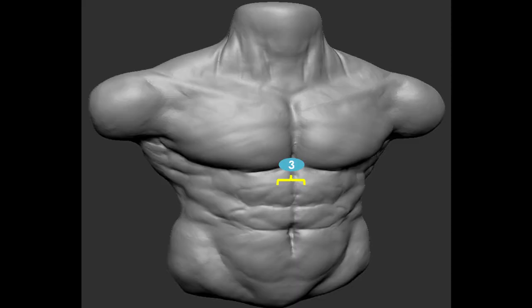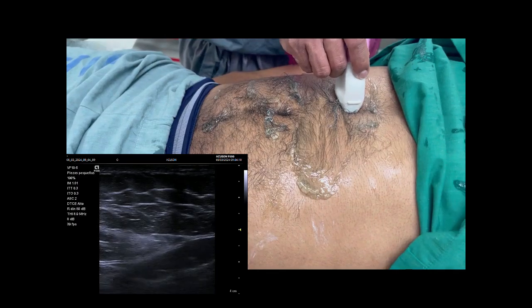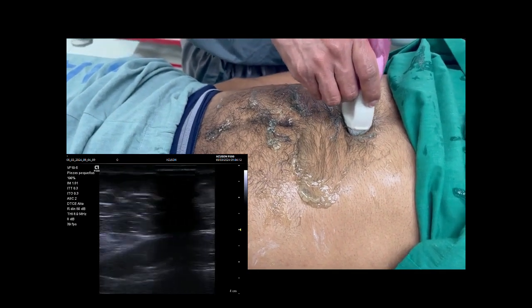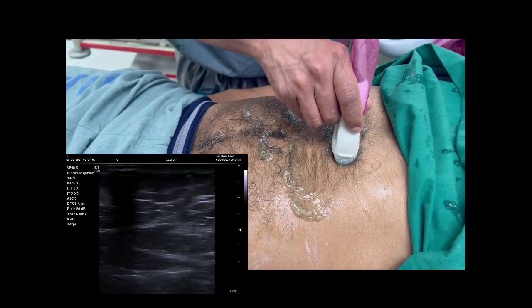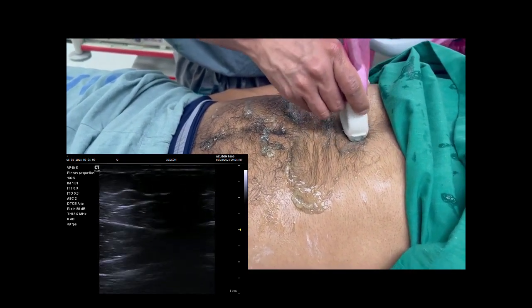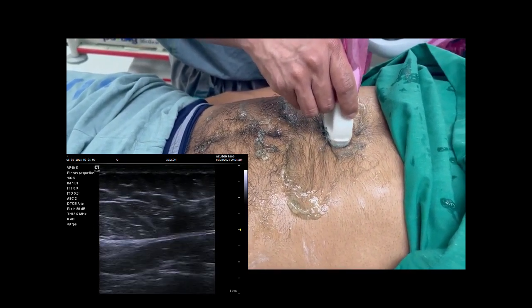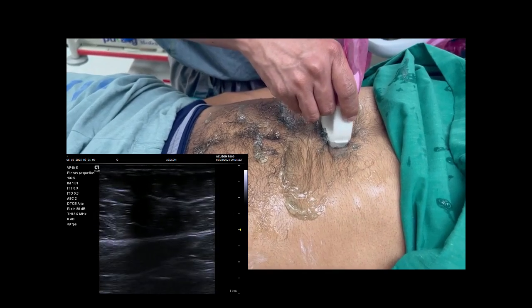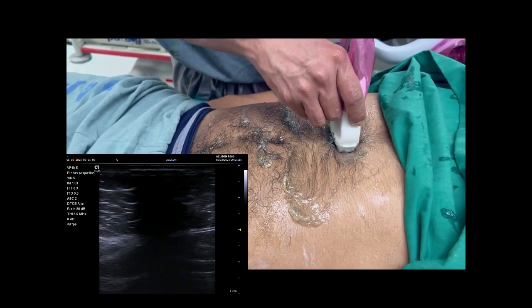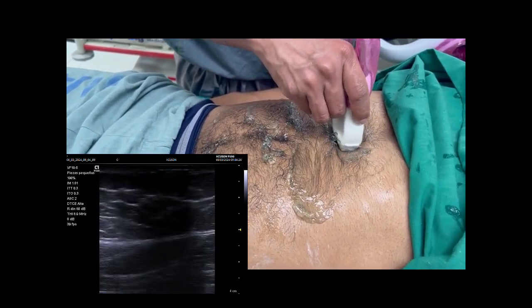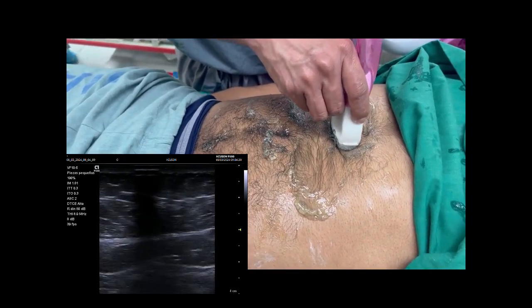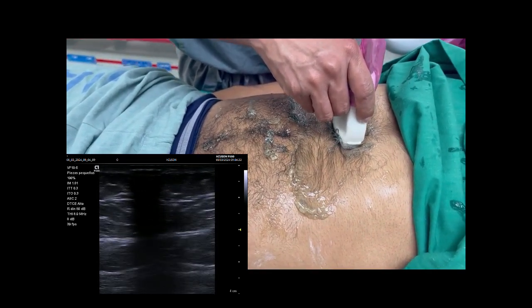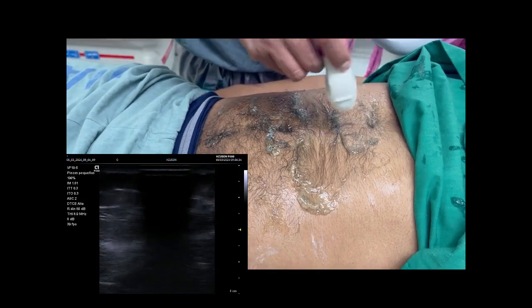In step 3, we measure the midline at the level of the epigastric and subcostal area. For an accurate evaluation, we locate the right rectus abdominal muscle, identify its medial border, then the medial border of the left rectus abdominal muscle, and finally measure the midline to rule out diastasis.